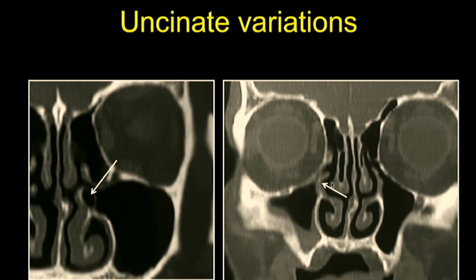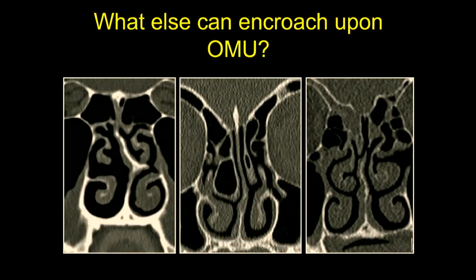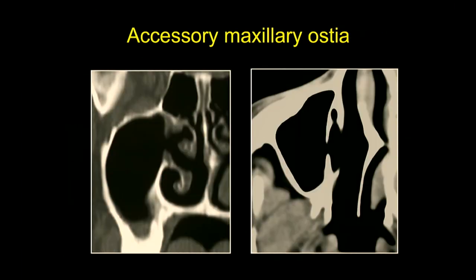An atelectatic uncinate is also associated with silent sinus syndrome. Other causes of osteomeatal unit encroachment include a deviated septum with a large spur, concha bullosa, and lamellar concha — the lamellar concha not involving the bulbous part of the turbinate generally does not have a significant physiological impact. A paradoxical curvature of the turbinate is another variation we see day in and day out on our PNS scans.